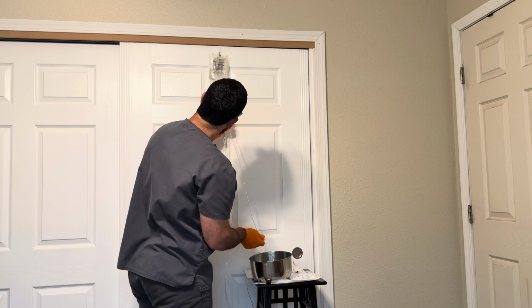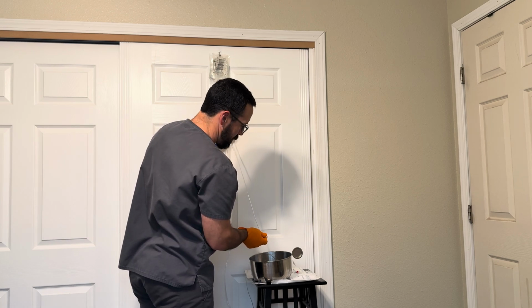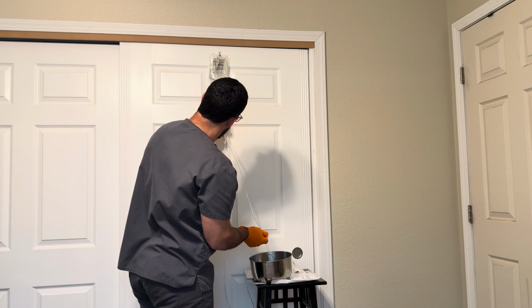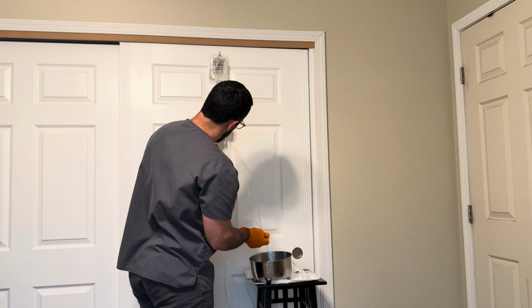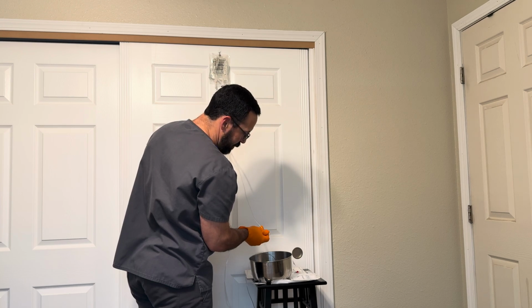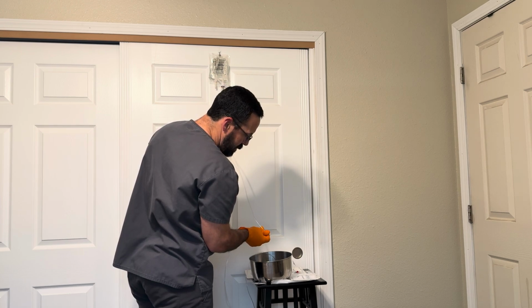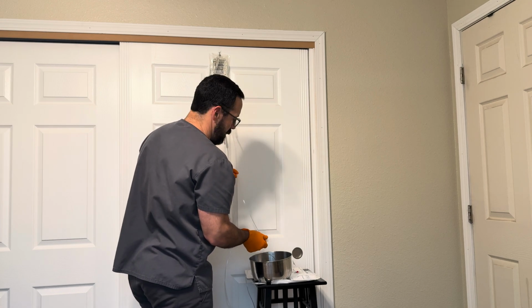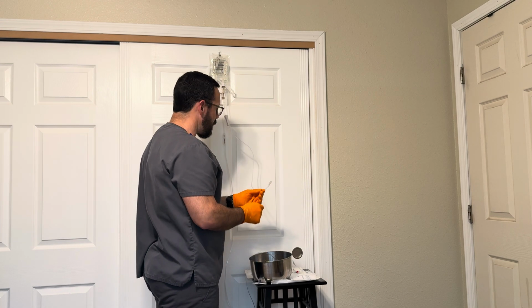And also I'm going to try to lose as little fluid as possible, because this is the medication that the patient is supposed to be receiving. That's actually a really clear line. So I'm going to lose almost no fluid, no medication. Perfect. All right, so our line is primed.